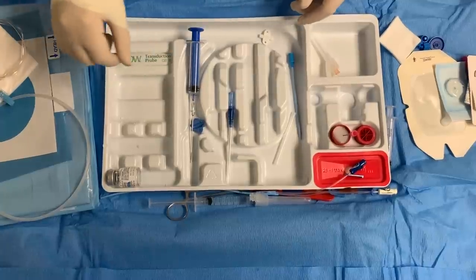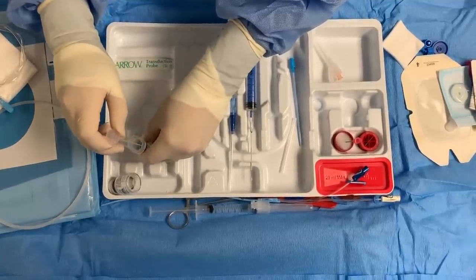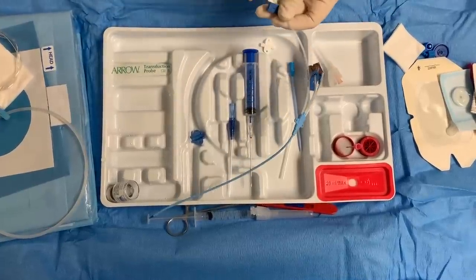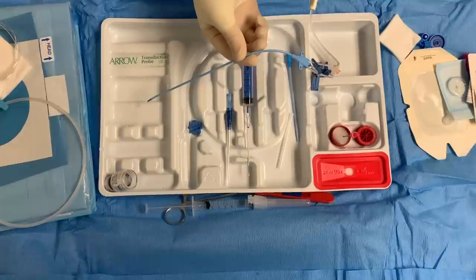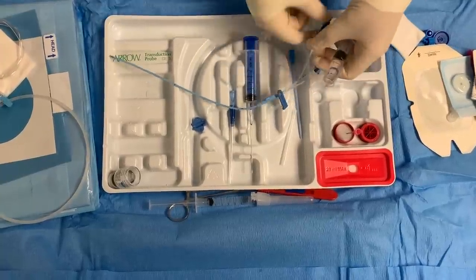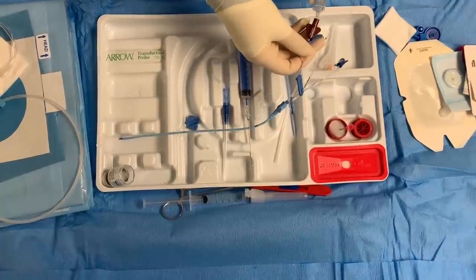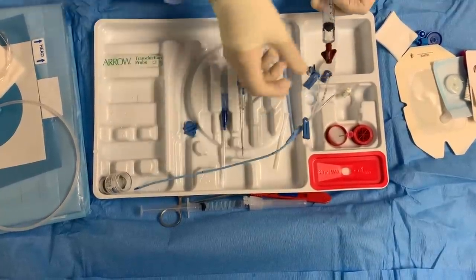You can take it out of the field. What you're going to do is draw this up. You're going to check every port to make sure it's patent, because you don't want a faulty one. You go like this and check to see if it's patent — it's patent. Same thing: you try the white, keep everything steady, try the blue and check — it's patent. Then you try your brown, check — it's patent. So all your equipment works.